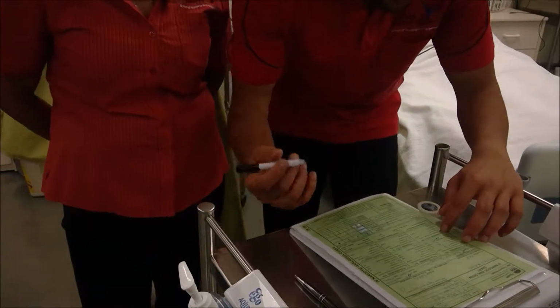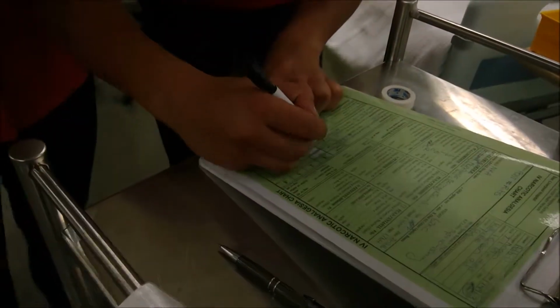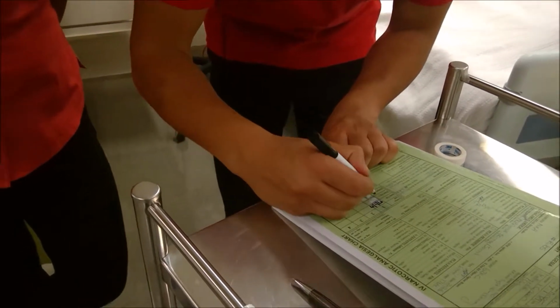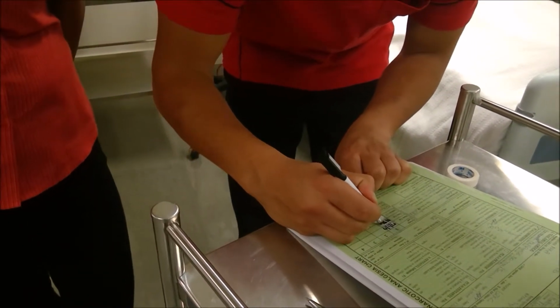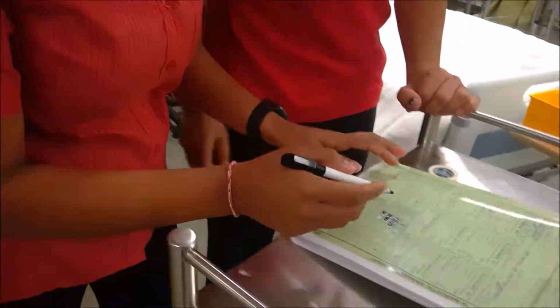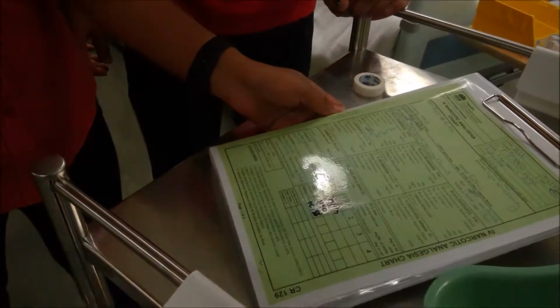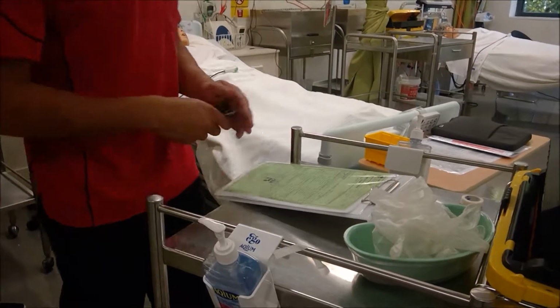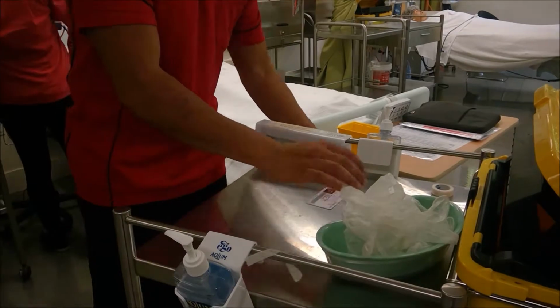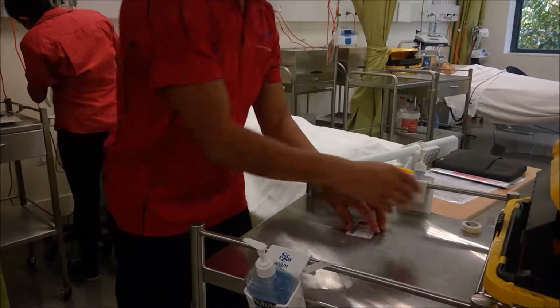Okay, second RN, I've just administered the morphine. I've taught her how to use it. I'll just sign and put the date, 17, 11, 30. Can I get your signature if you agree? Yeah, I'm just going to clean up my area. That's it.